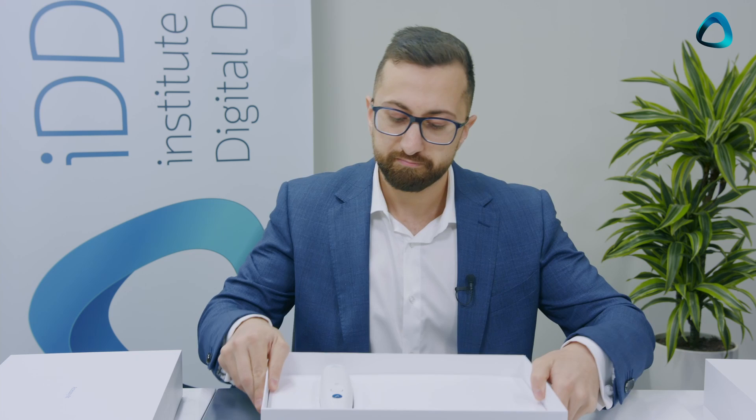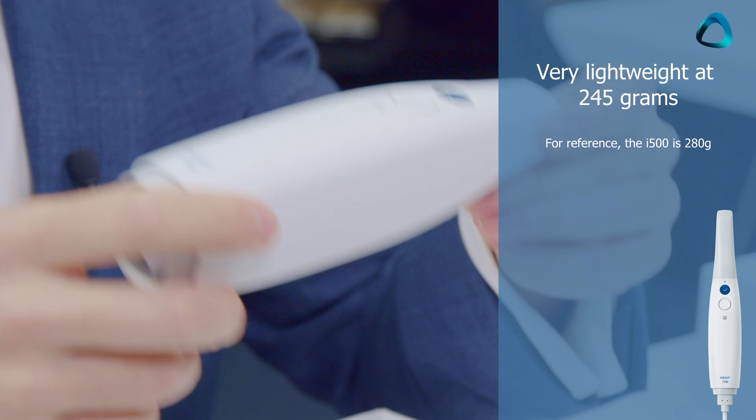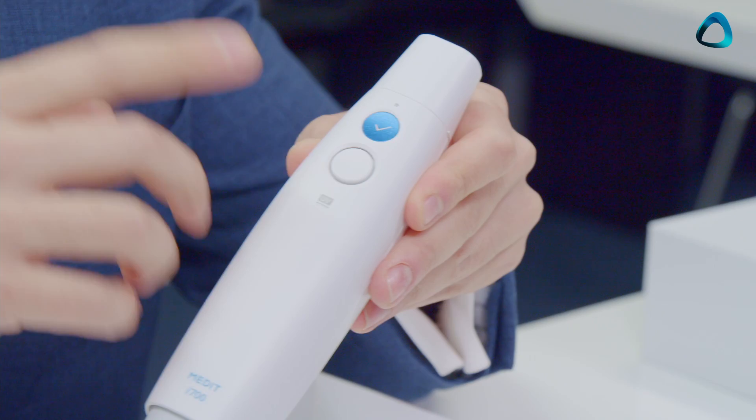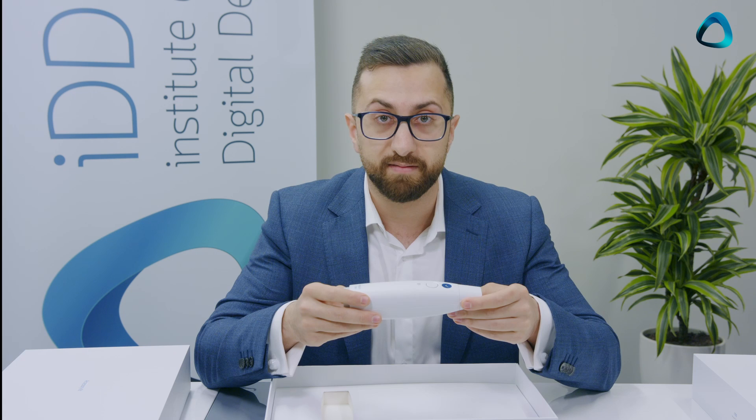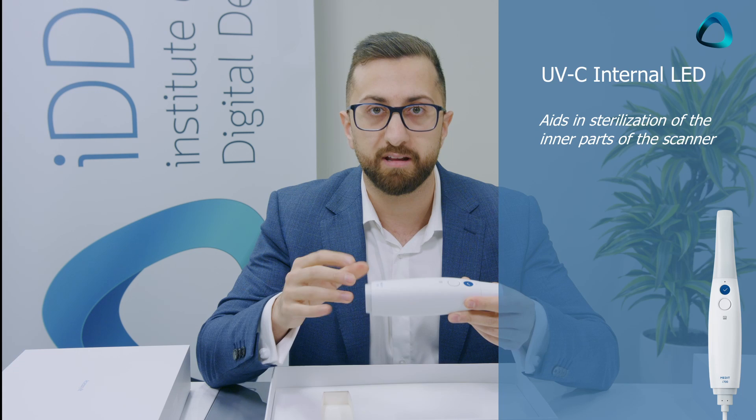A few things about the scanner: this is obviously the Medit i700 and instantly you'll notice it's quite small — 245 grams, making it one of the lightest scanners on the market. You've got a control button that lets you control different applications without touching the laptop keyboard, and then the scanner button — really the only two buttons. You'll also notice this interesting UV light symbol. What this scanner does — completely unique to the Medit i700 — is use a UVC LED to disinfect the inside of the scanner. I've never heard of anything like that in the whole market.